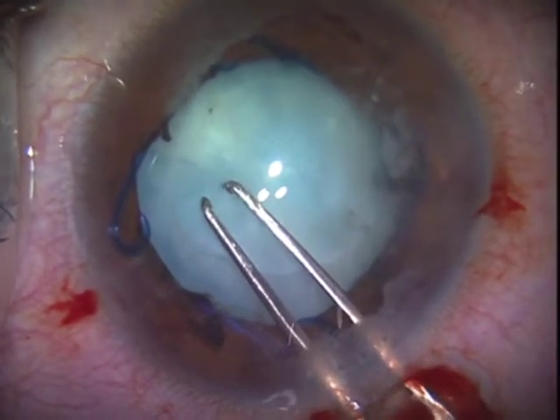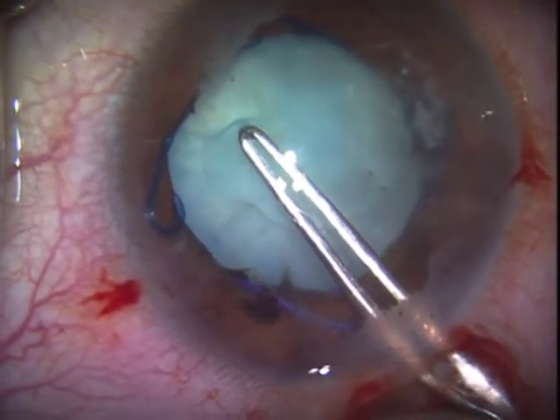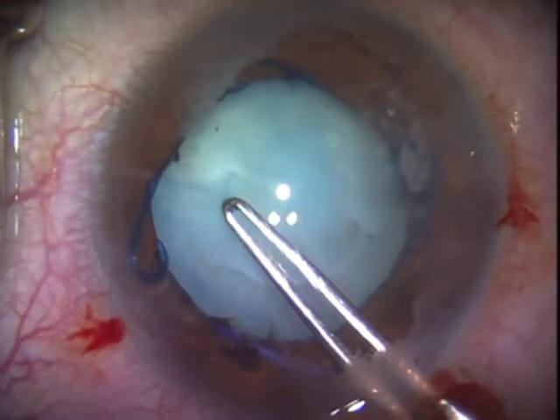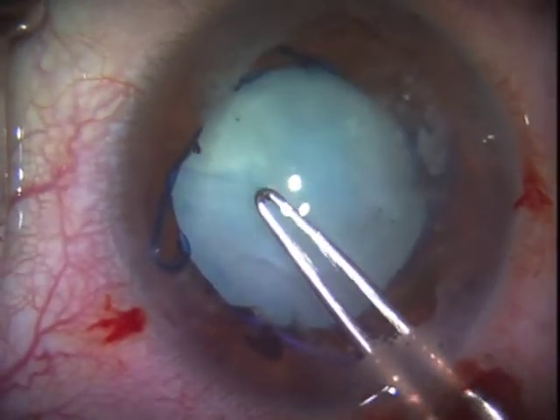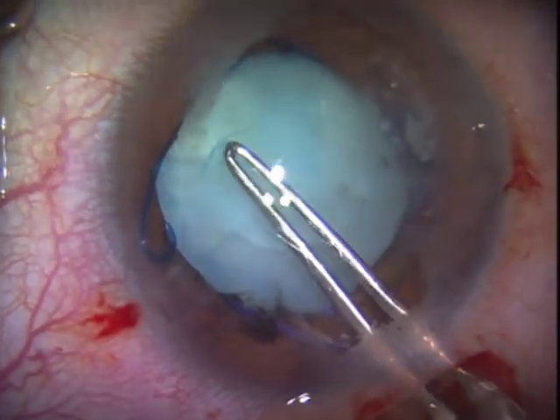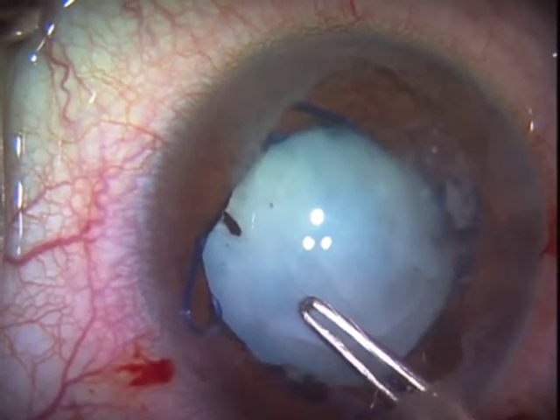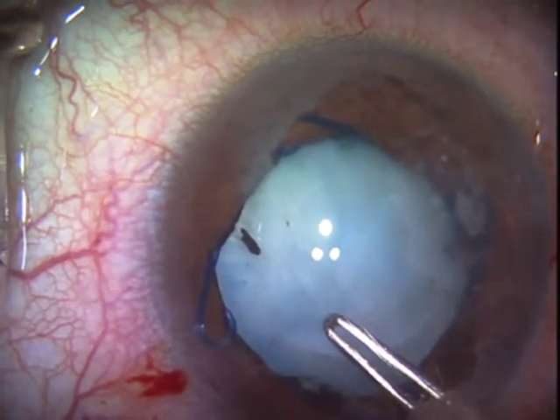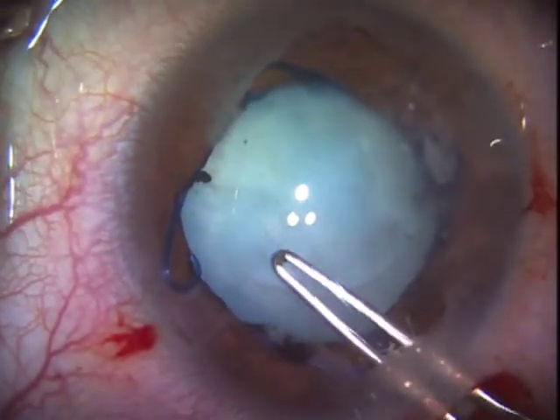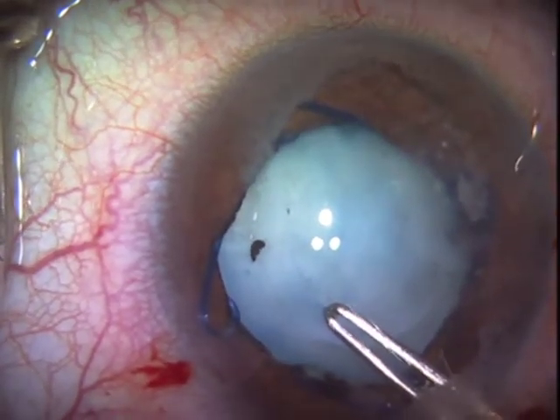After finally getting a little opening, we're going to try to tear, but this very fibrotic capsule will surely present a challenge. I don't have a fugo blade, but this is a case where other than tearing is necessary.